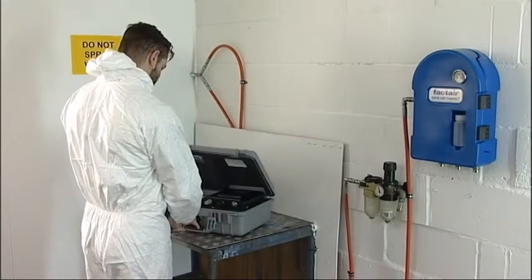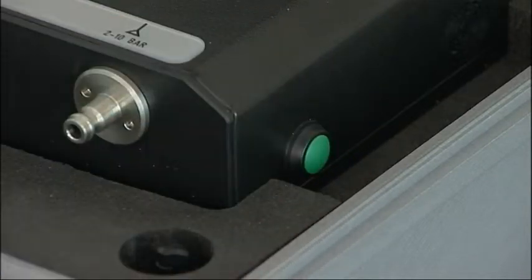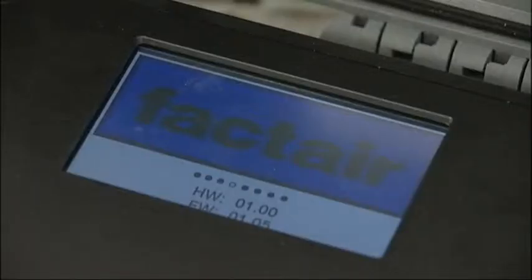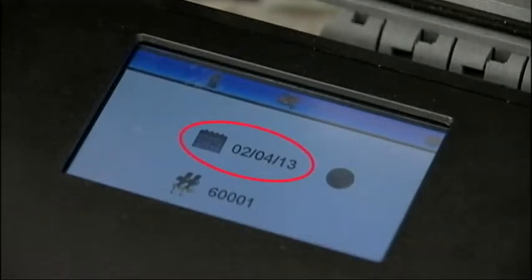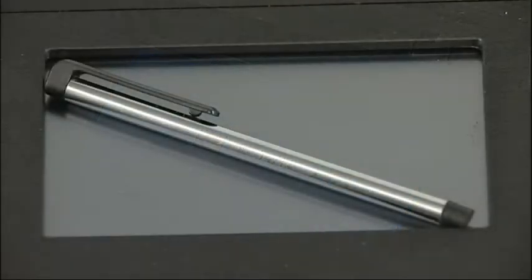To carry out a test, first switch on the machine by pressing and holding the green ON button located on the right-hand side of the unit for approximately 3 seconds. The display will show the date last calibrated, serial number, and a tick or cross symbol will indicate whether it's within the recommended calibration period.